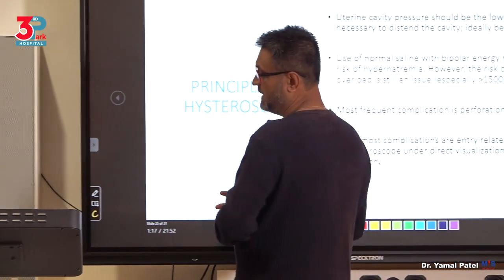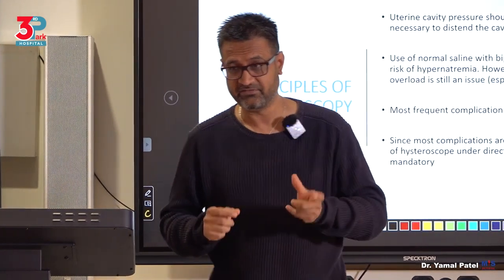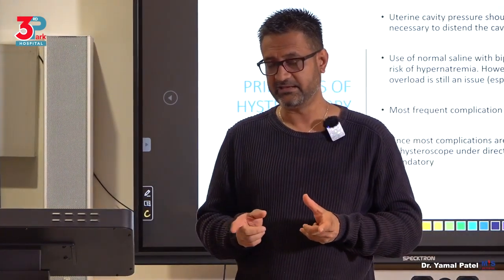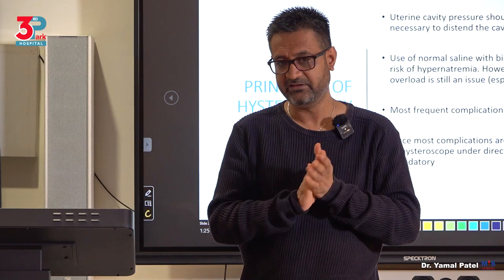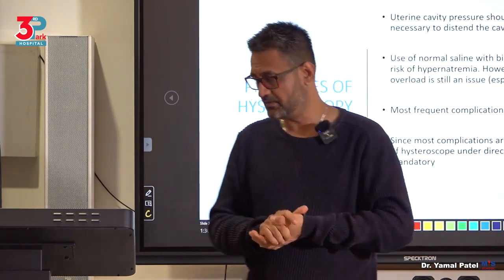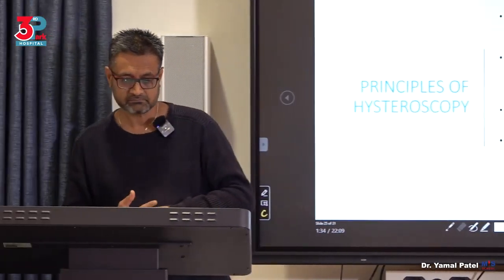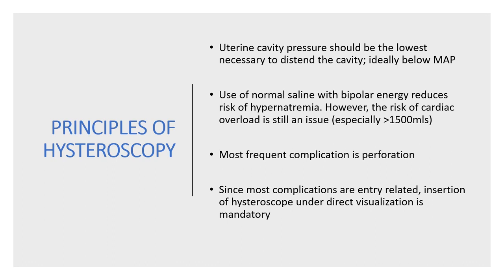Okay. I told you hysteroscopy, frankly, is a short procedure, but a very dangerous procedure. I'm repeating it again. Very likely to cause complications if we are not careful. So, a few principles to avoid those. Number one, the uterine cavity pressure.